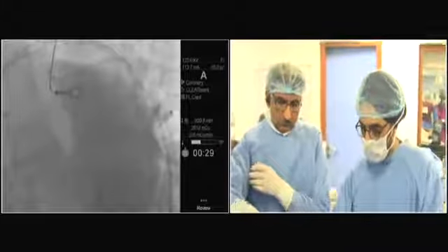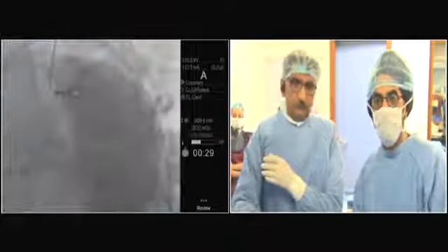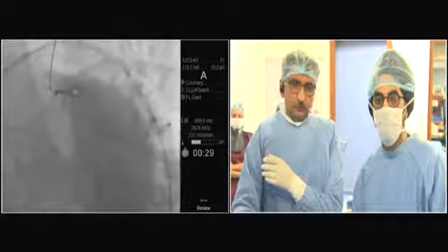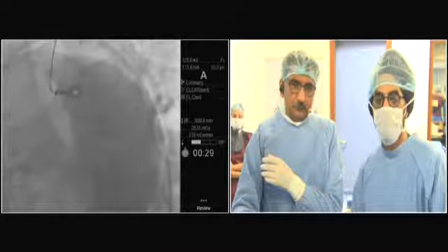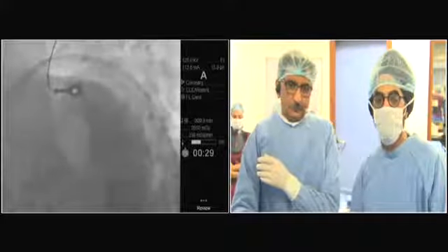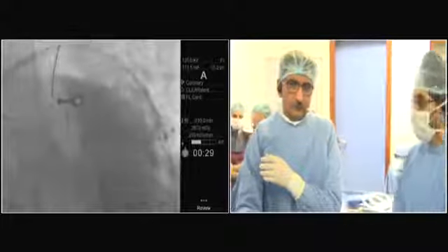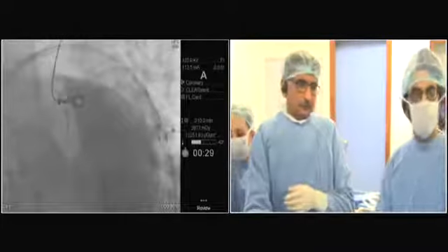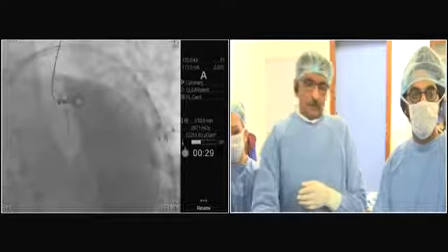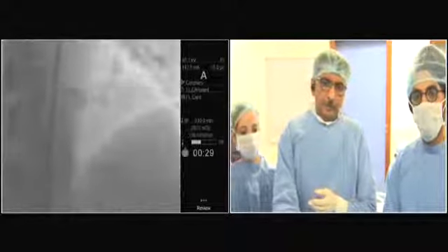As you said, the lesion in the diagonal is very, very long, and there is still a tight lesion distal to the diagonal stent. Yes, I saw. We don't know where to stop here, because if you increase the length of stent, then you increase the risk of stent thrombosis. So maybe the option of doing a provisional with a kiss and looking at what occurs on the side branch maybe was a good option.